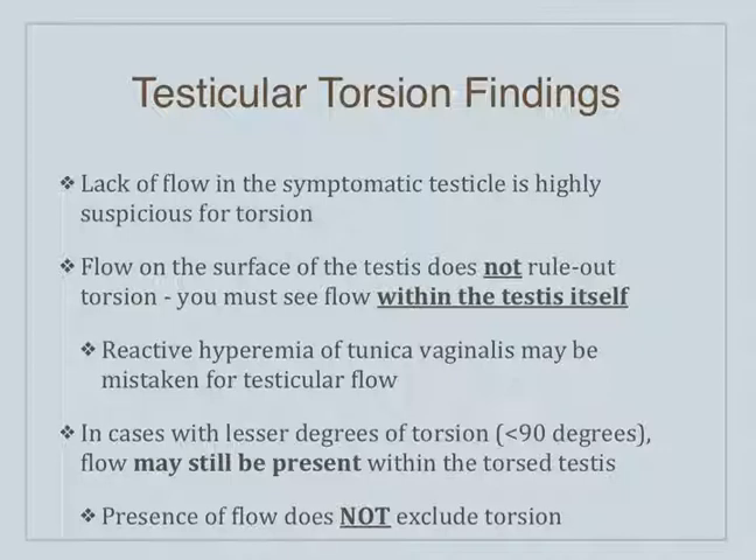You can see flow around the surface of the testicles, but that doesn't rule out torsion. You need to see the flow down in the testicle itself — the blood vessels that penetrate through the testicle. You can have capsular flow around the outside surface of the testicle, but you need to see the centripetal vessels, the ones that run through the testicle. We can also have reactive hyperemia of the tunica vaginalis — that's not testicular flow. You need to see the penetrating vessels.